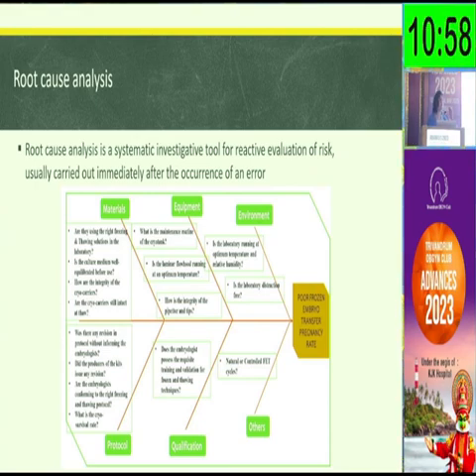Sometimes we change everything: media, CO2, triple gas, the culture media, the water that we use, the oil that we use, the consumables. We change one at a time to ensure that we know where the problem was, but still nothing happens. But then, at the end of it, sometimes suddenly something happens and our results might become much better. But sometimes we have found one particular, specific problem.